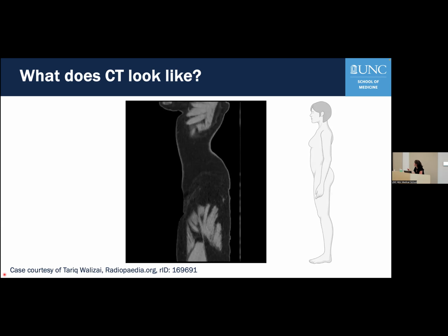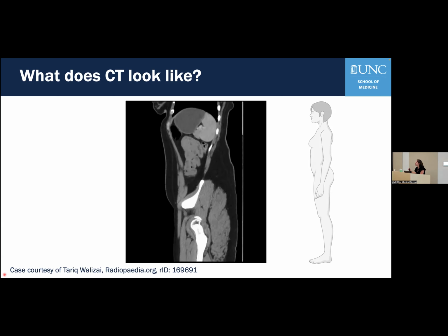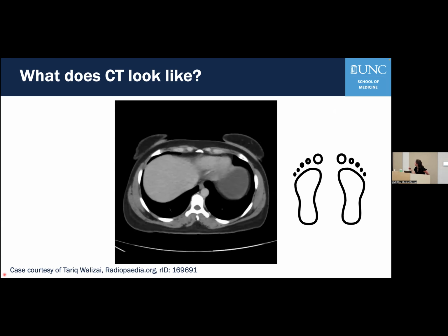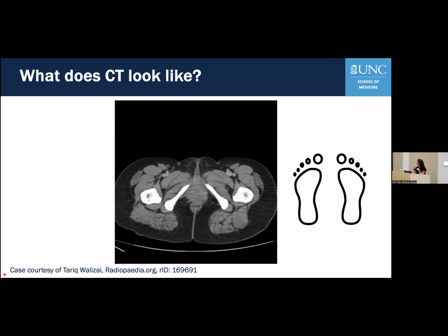Here's another view. Imagine this person here standing on their side. So we're scrolling through their side. And you can see all of those organs again, visualized in this really great 3D way. And then we have a final view we can look at. So imagine that you're looking up at a person with their feet out facing you. And this is starting up high and then scrolling down towards their feet. So you can see this is their heart there. And then as we're scrolling down, we can see liver, kidneys, all the way down until we see their legs.